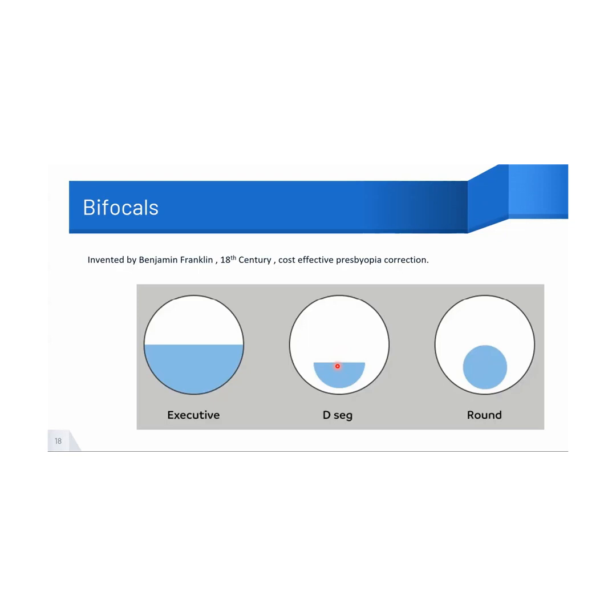You need to understand the basic concept: optic center to optic center, the longer the distance, the more the image jump. That is number one. Second thing, the longer the distance, the more easily they can be converted to a regular progressive, because a regular progressive is also going to have a longer progressive corridor. Okay, now having said that, let me move on.